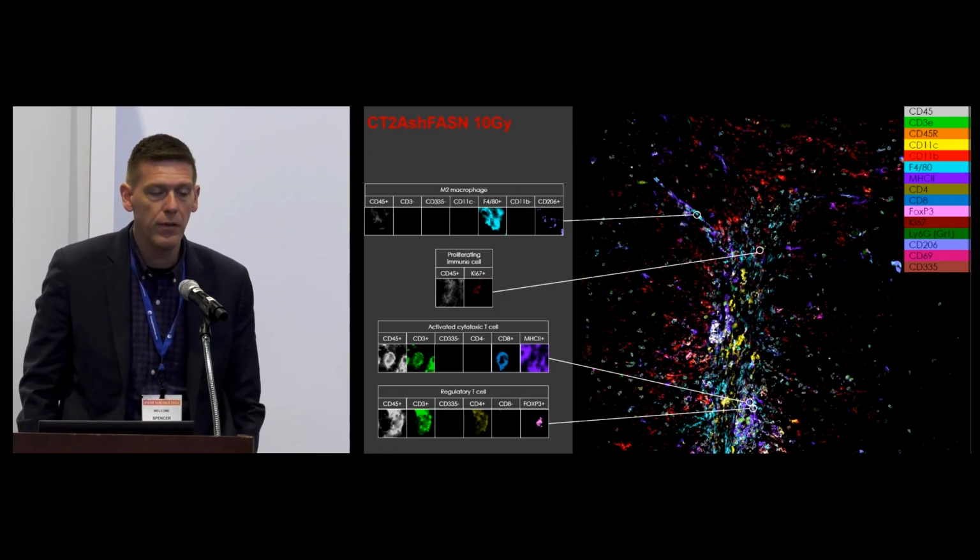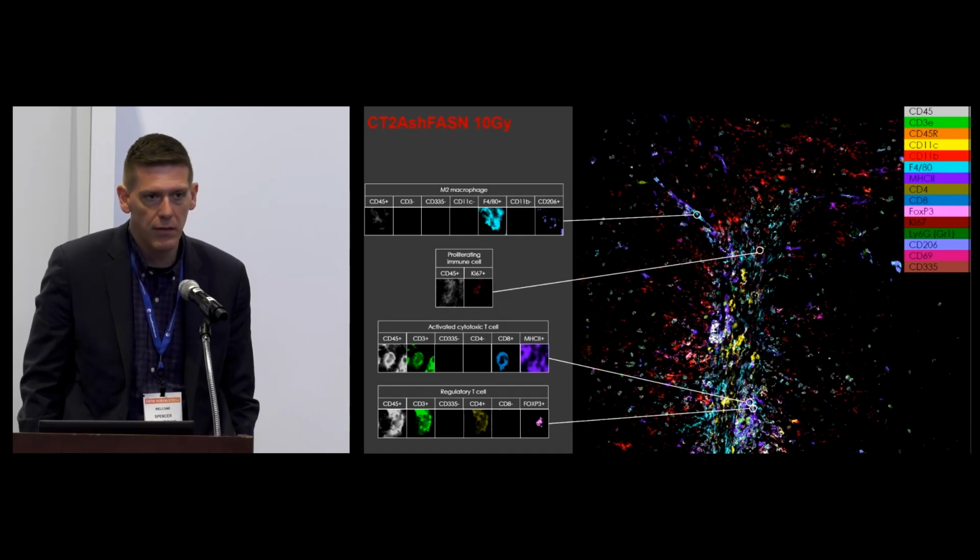Yes, frozen or FFPE. Essentially, anything that you can prep through a typical histology process is something that we can use. So there's nothing specific about our reagent system or anything like that.